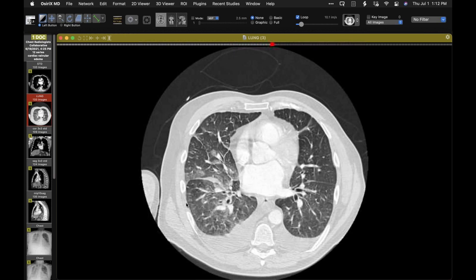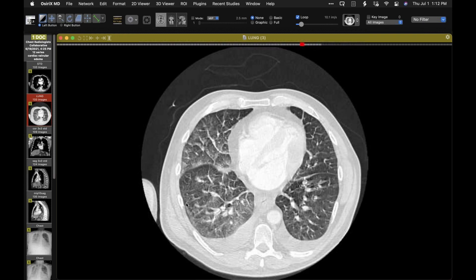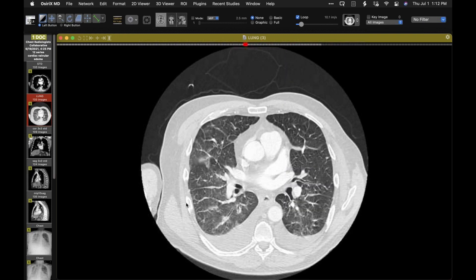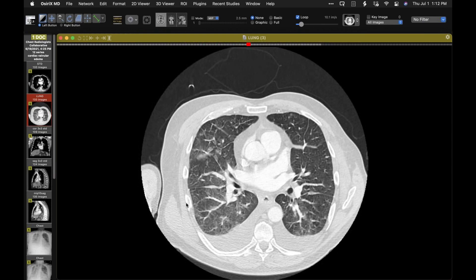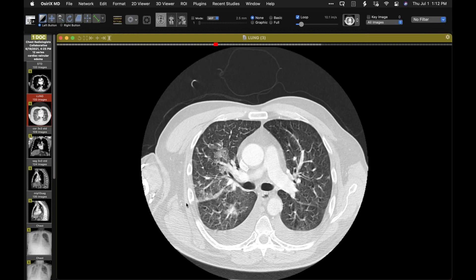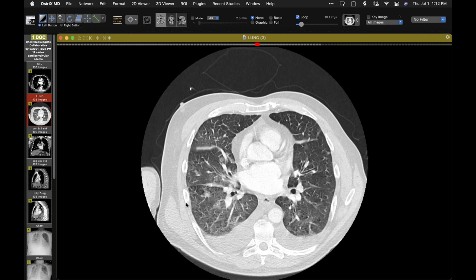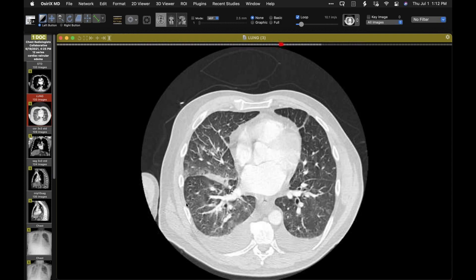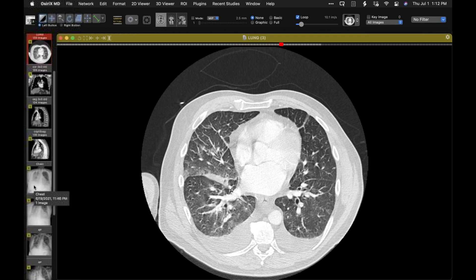There's edema everywhere. Very nice demonstration of interstitial edema, bilateral pleural effusions. So what is the cause of acute lung edema that's particularly extensive in the right upper lobe? We've shown a few cases before, but this is the nicest one — which is mitral valve regurgitation incompetence.